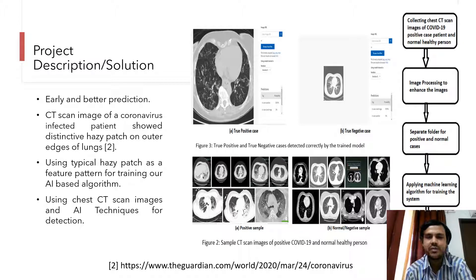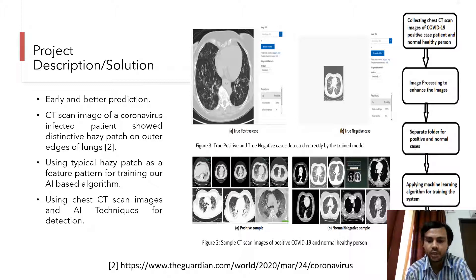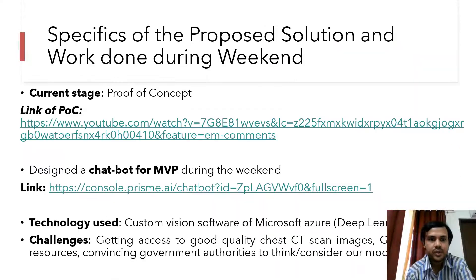As you can see in Figure 2, 'A' is the positive sample and 'B' is the normal sample. In Figure 3, true positive and true negative cases were detected correctly by our trained model. These are some of the specifics of our proposed solution.